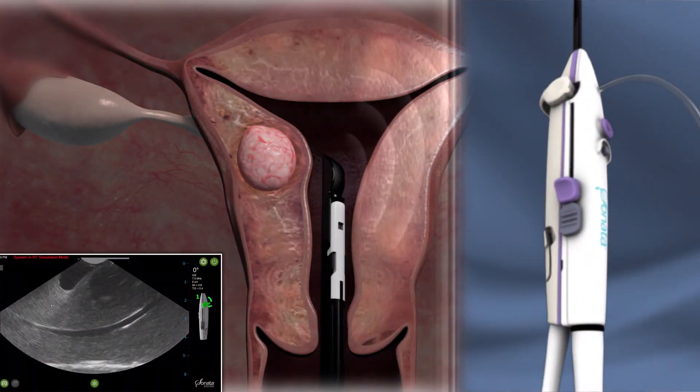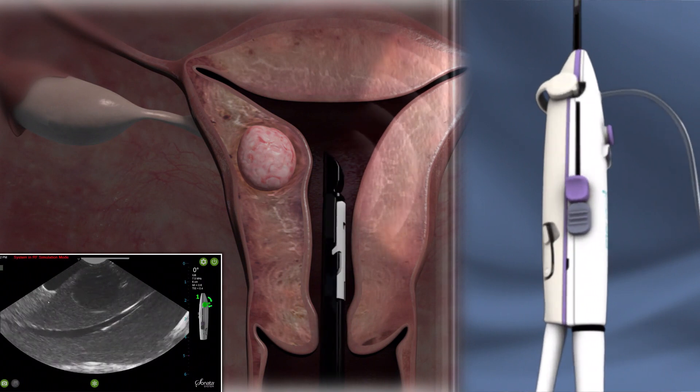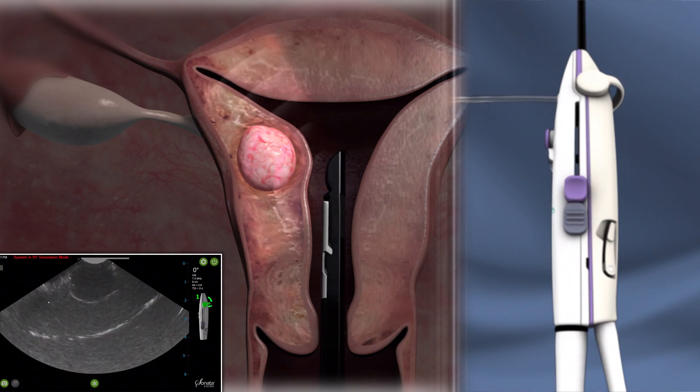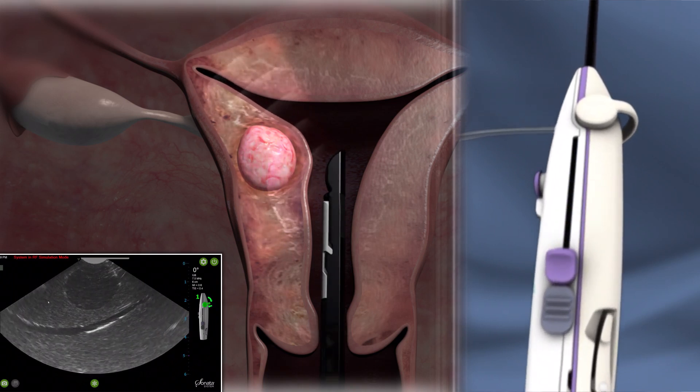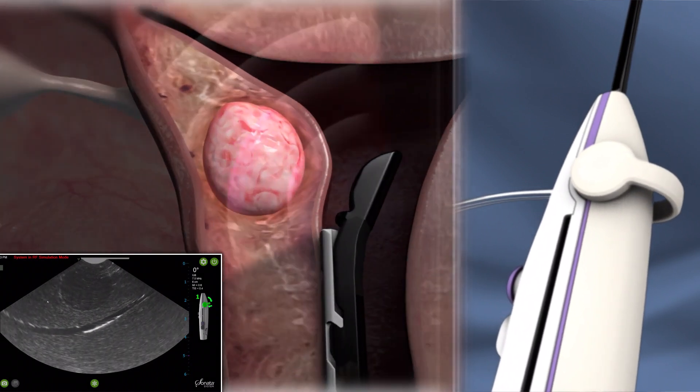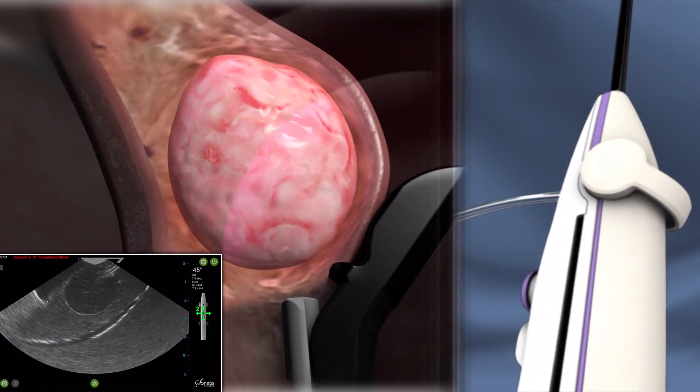The Sonata treatment device is inserted through the vagina and cervix and into the uterus. The intrauterine ultrasound probe allows the physician to survey the uterus, locate fibroids, and target specific fibroids.